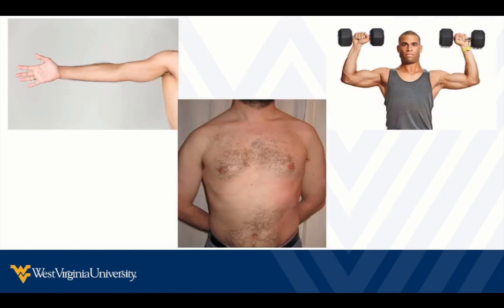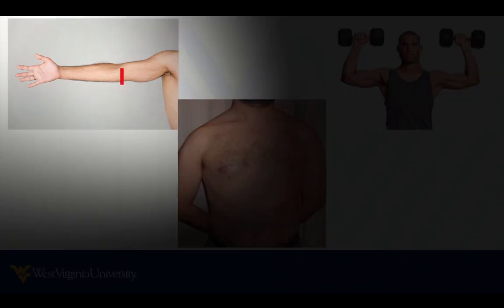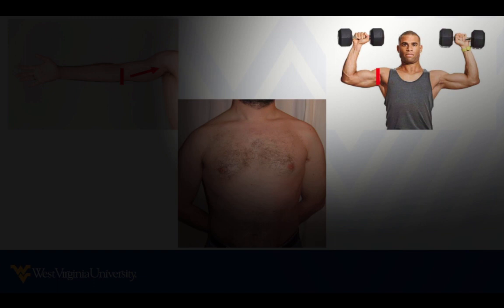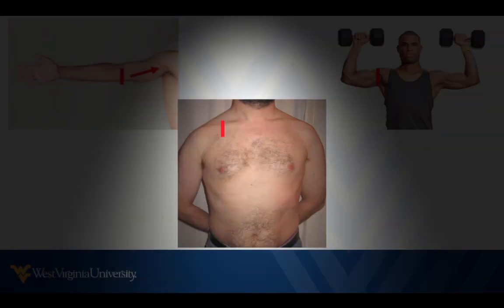I usually start distally and work my way up — that's just my preference, no real science behind it. But try to have a consistent method so you don't miss things. I start with the brachials, which are going to be medial. All of the deep veins are touching arteries. I generally follow the brachial artery and its associated veins up the arm as far as I can, then get into the axillary and make sure the veins compress. Then the subclavian vein, and lastly the internal jugular.